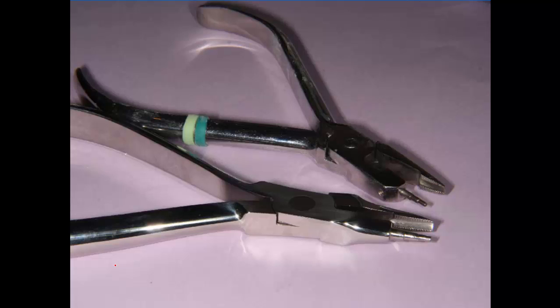There are two pliers here, loop forming pliers. This is what we call a tweed loop former, and we call both of them that. This one though is built here in the States. It's a very expensive plier, but it's the best loop former plier that is made as far as I know. This little insert comes with this, and it goes in, it has a little Allen screw that goes in here, tightens it up, and that's made out of some tough metal. I've never broken one of those, but they come with an extra one. You can slide one out, put another one in.